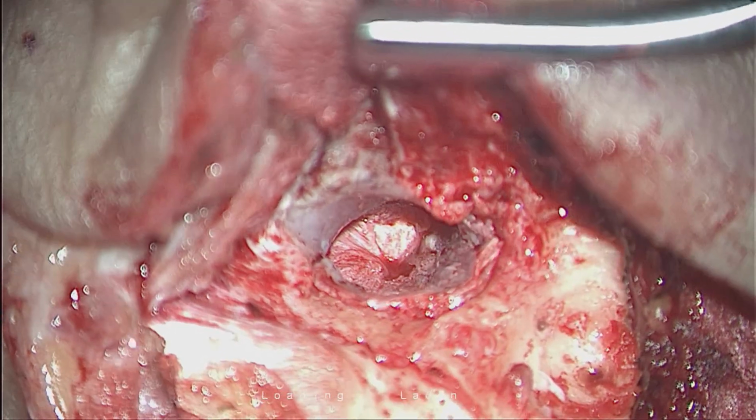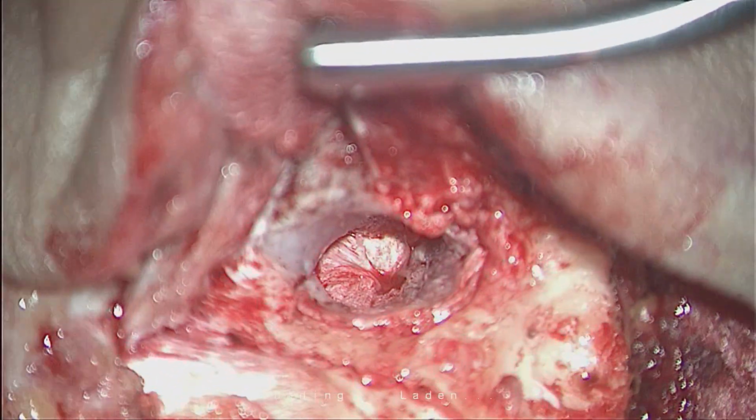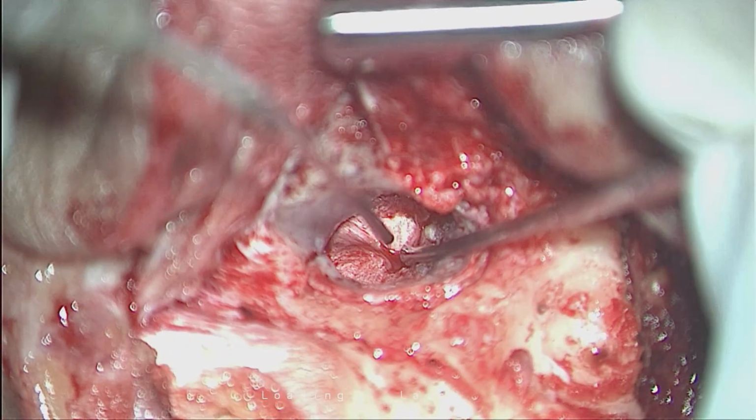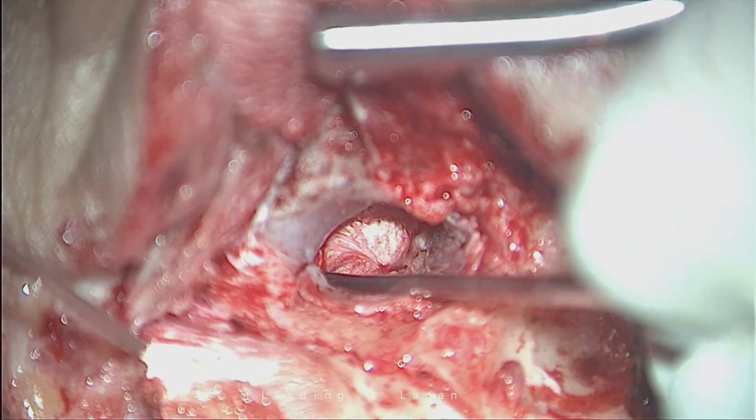Yes. See all around. This is the second part. See now, and you can see the cone of light from the umbo. Correct. You already have a light reflex. Yes. This is the second part.